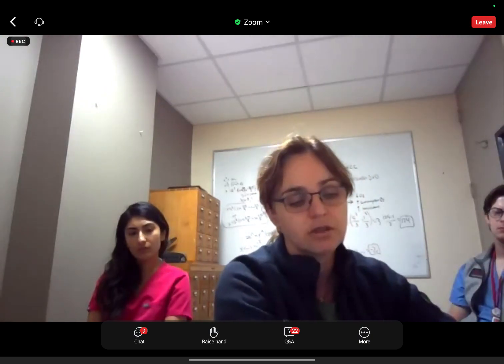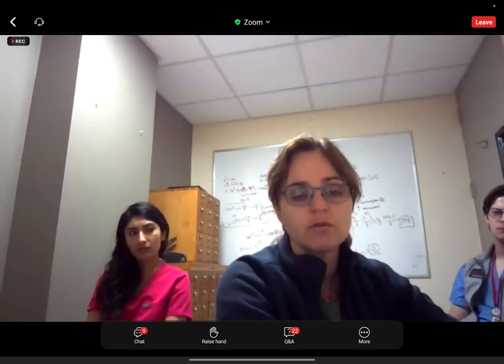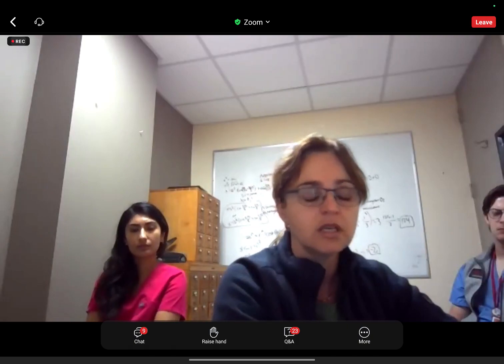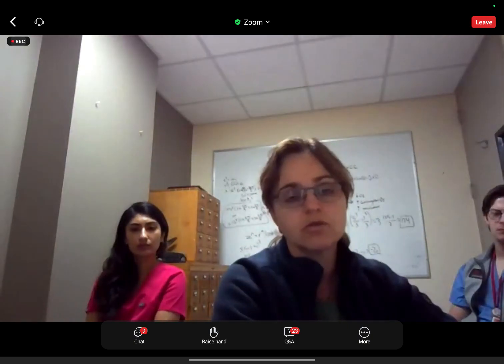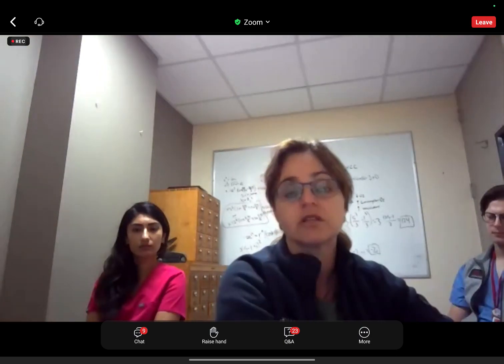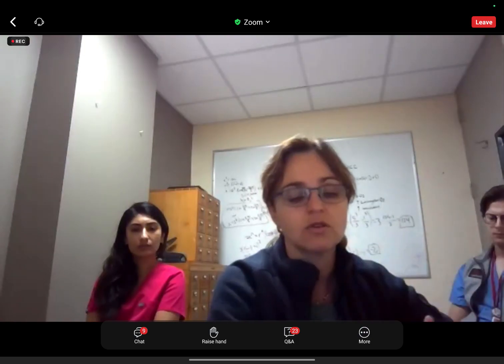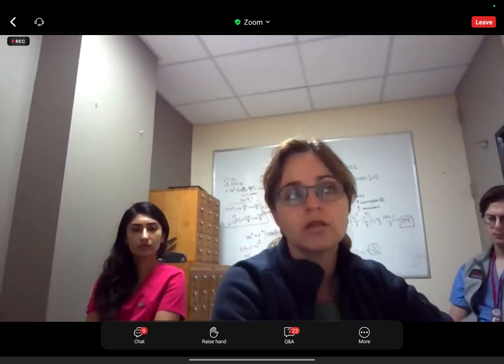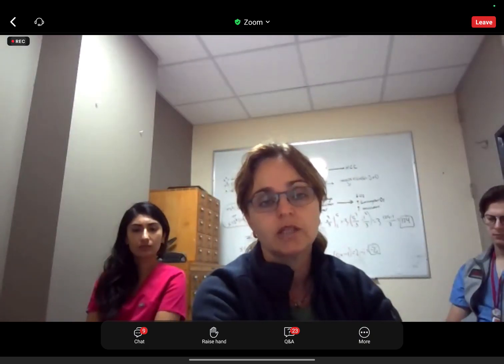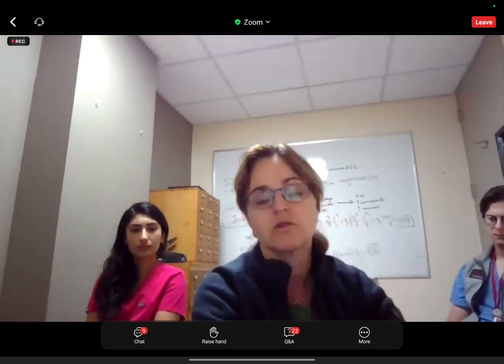And if you look at any particular study, those numbers are impressive. The problem is that the actual ADC values are very, very dependent on technique, the scanner, the patients, so many variables that the numbers that you get in one study are often not translatable to another study, to another setting, another scanner. So at this point, we do not use quantitative data from ADC map. And it's just visual assessment if you see diffusion or not.